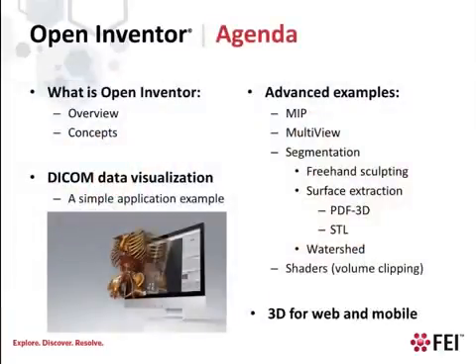Here's an overview of what we'll be talking about today. First, an overview of Open Inventor concepts and features. A quick look at what coding with Open Inventor looks like. Then on to demonstrations of some medical applications and workflows that Open Inventor enables.